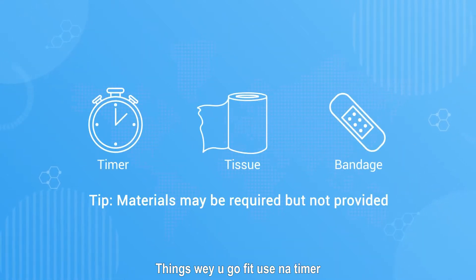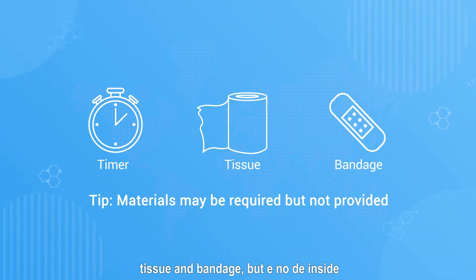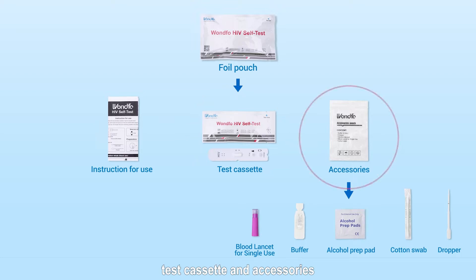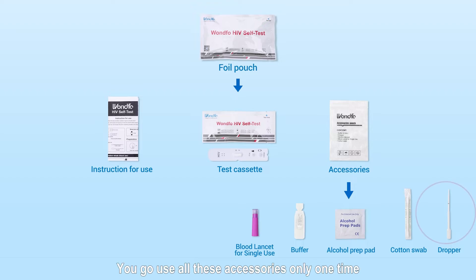Materials like timer, tissue, and bandage may be required but not provided. The foil pouch includes instruction for use, test cassette, and accessories. The accessories are blood lancet for single-use, buffer, alcohol prep pad, cotton swab, and dropper.